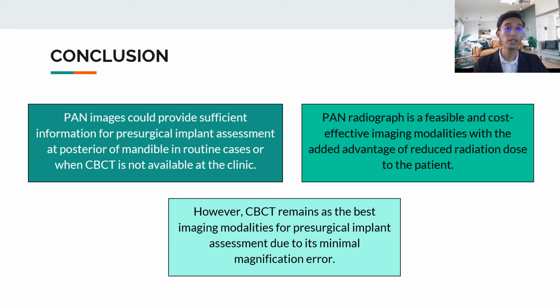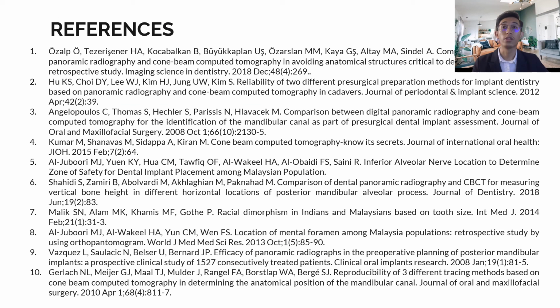However, currently, CBCT remains the best imaging modality for pre-surgical implant assessment due to the reason that CBCT has minimal magnification errors. So these are our references.